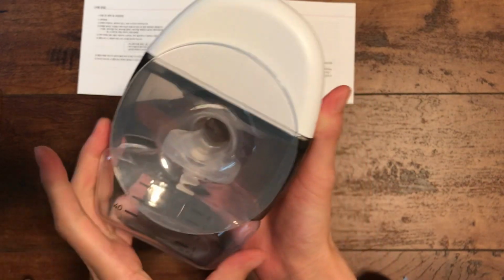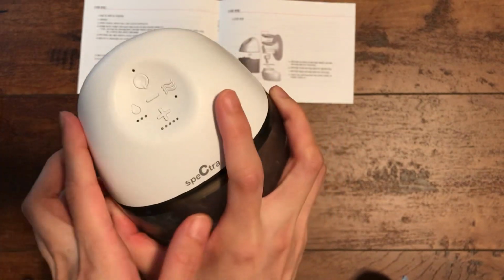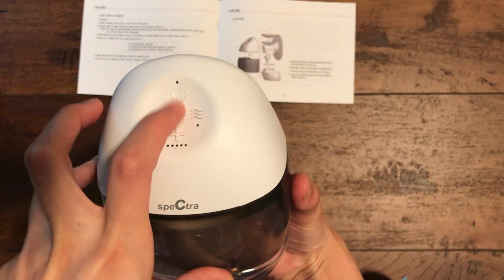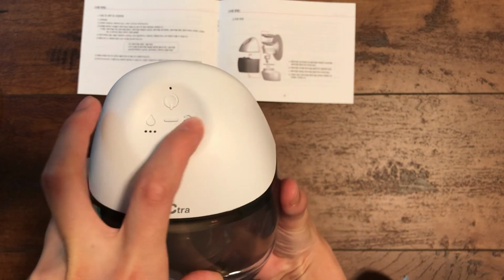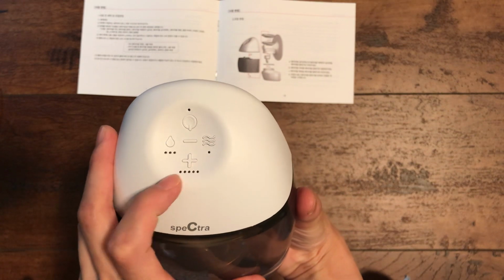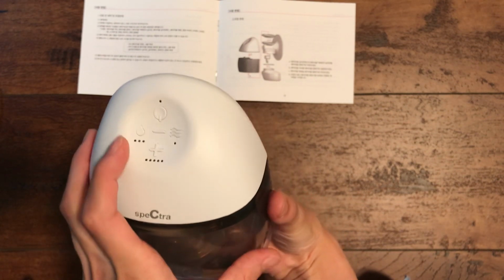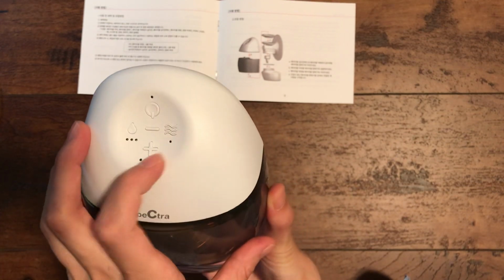And then to go over how to use this product. I think one of you guys had questions about different modes, so I'll go over the functions again. This is the on and off button. And then this wavy thing is the massage mode. And this is the expression mode. And these are just plus and minus signs to increase the intensity of either the massage mode or the expression mode. I think in the last video I wasn't very clear about these different modes and intensities.